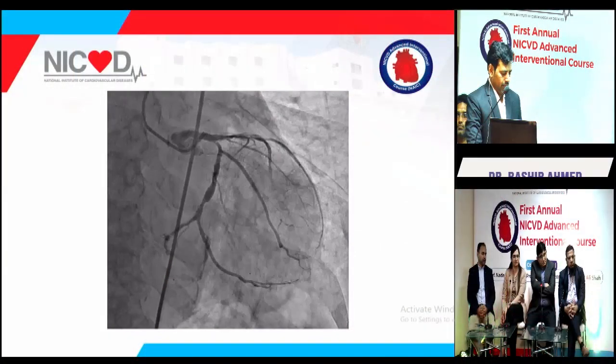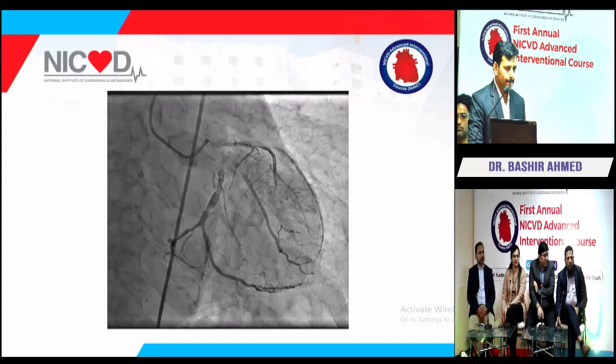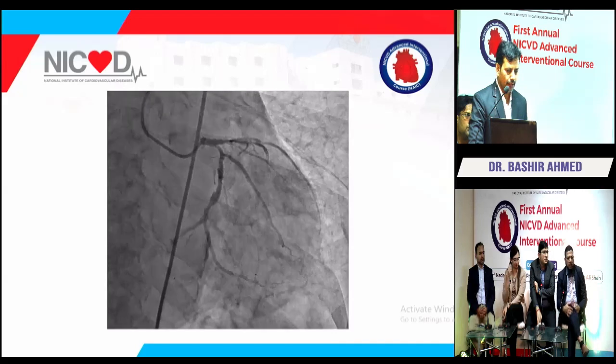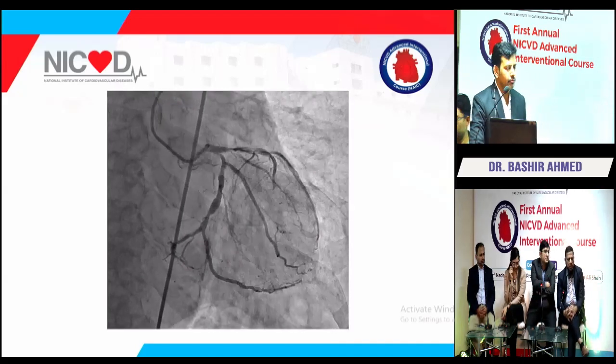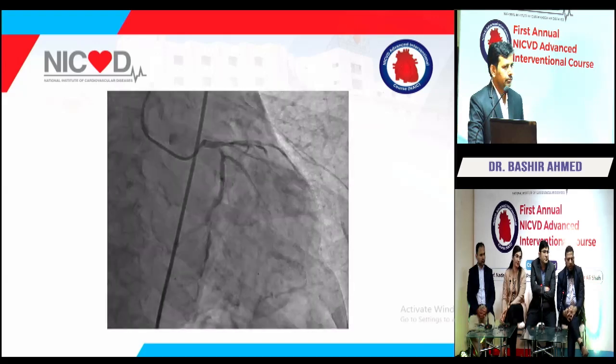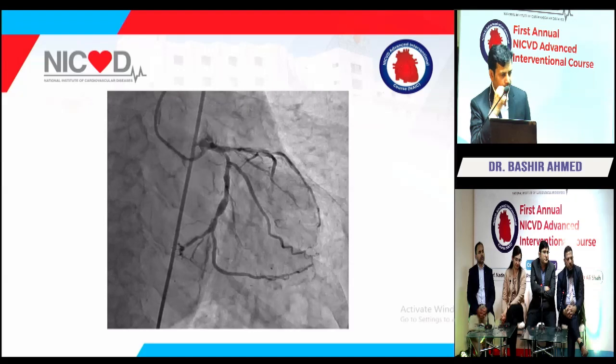There is still a risk. So can we use this in those cases, if we suspect there is higher calcium that is not going to let the stent expand? I think you are talking about doing your angioplasty in a normal fashion and putting a stent there, and ultimately you find out that your stent at a certain point is not yielding because of the calcium, right?